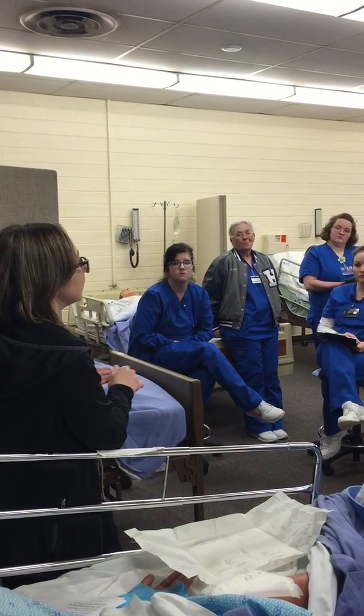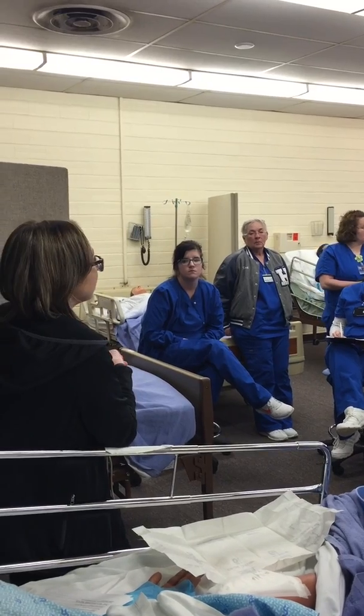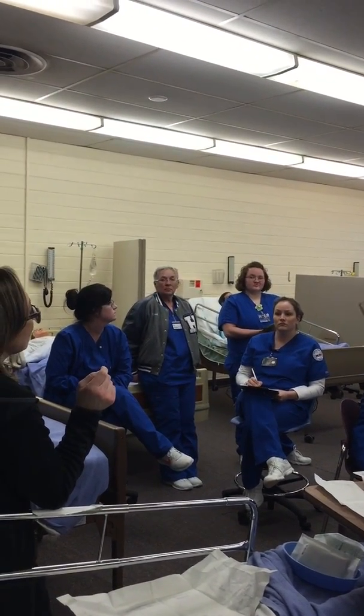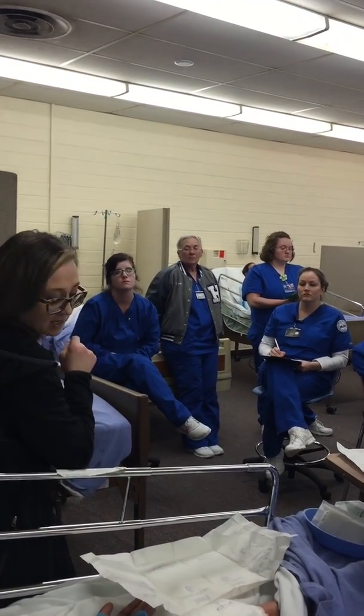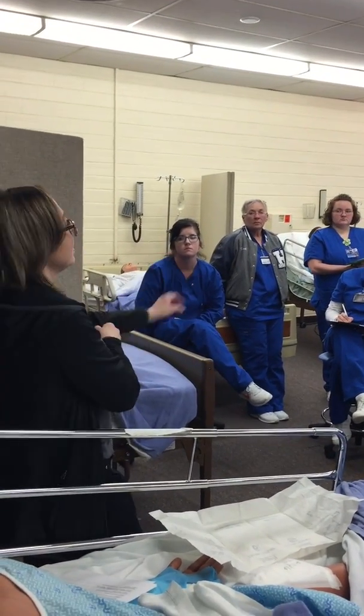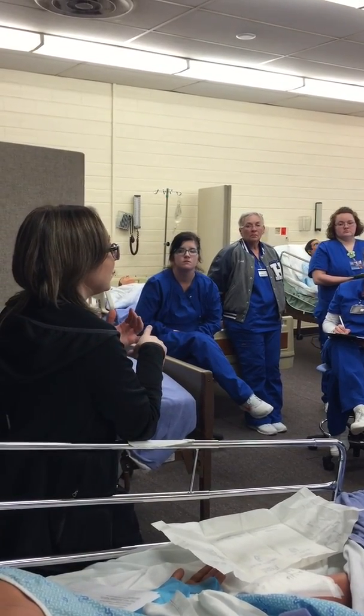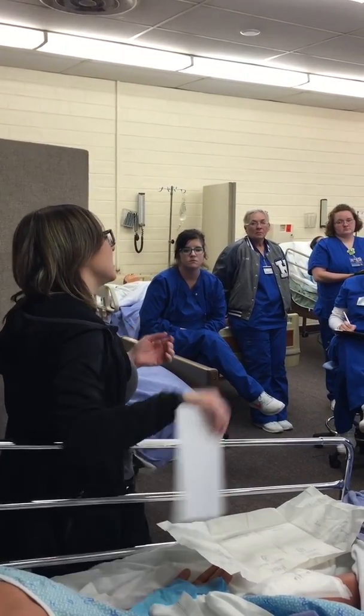The patient tolerated well. What is one other thing that you're going to have them check, the depth? Is that what the cotton swabs are for? That's what the cotton swabs are. Is that on the sheet? It's not on the sheet, but I just want them to be aware of it so that you'll know, because some facilities will want you to do that.